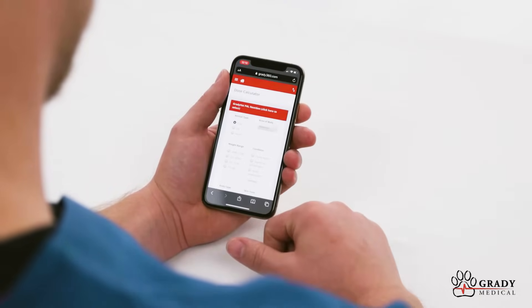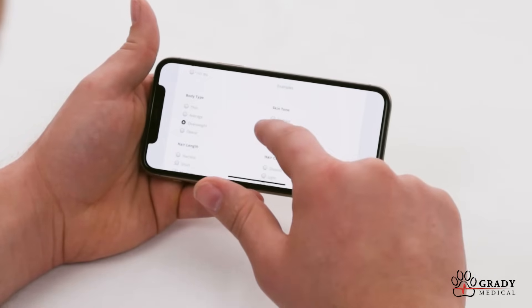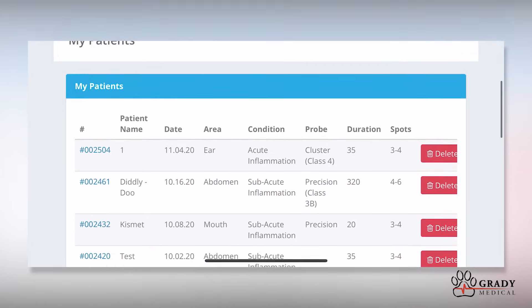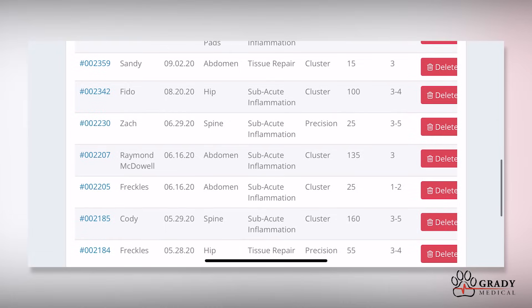Under the Dose Calculator tab, enter in all the patient details including animal type, weight, body type, skin color, hair length, hair color, and lastly, the condition as well as the affected area of the body. Click on Patient History to view all of your data and start smartly tracking treatment progress over time.